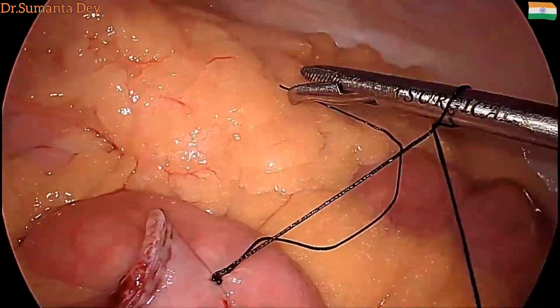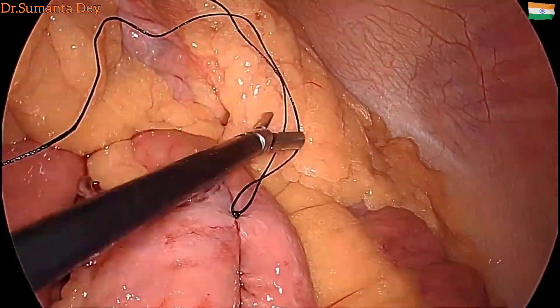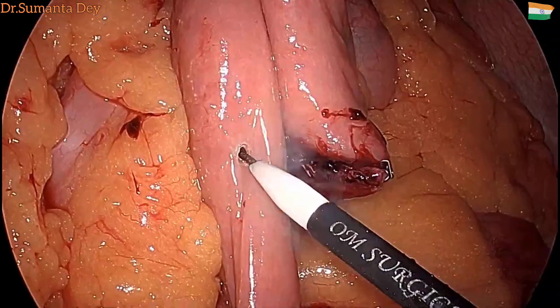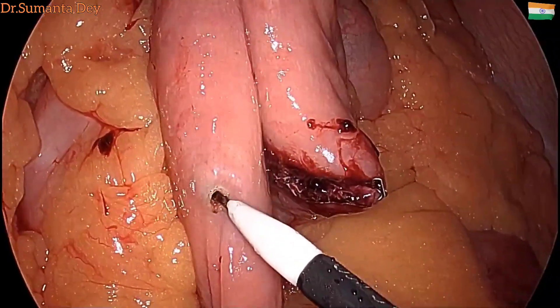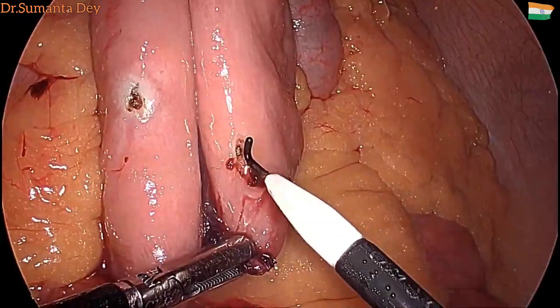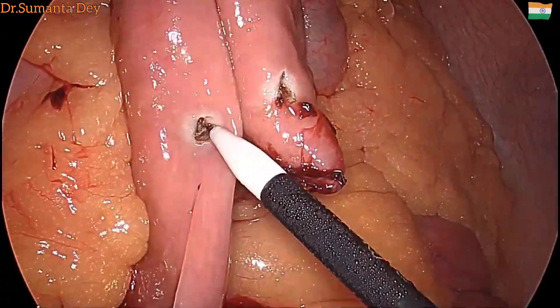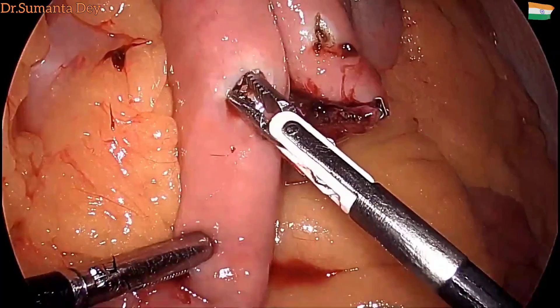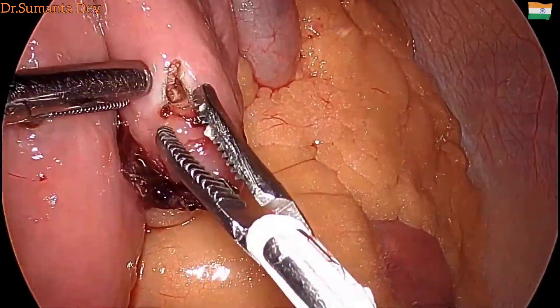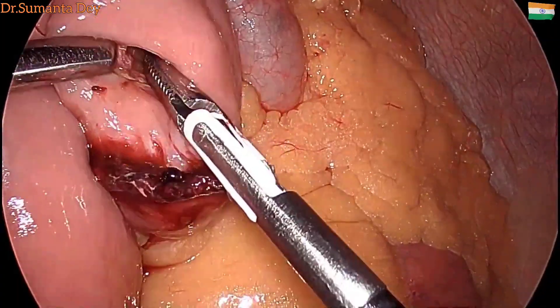I am taking a stay suture of the proximal and distal jejunal ends, keeping them at the site — it will act as traction. After that, doing enterotomy with the cutting mode using a hook, and then enlarging the hole to allow the end of the GI stapler.